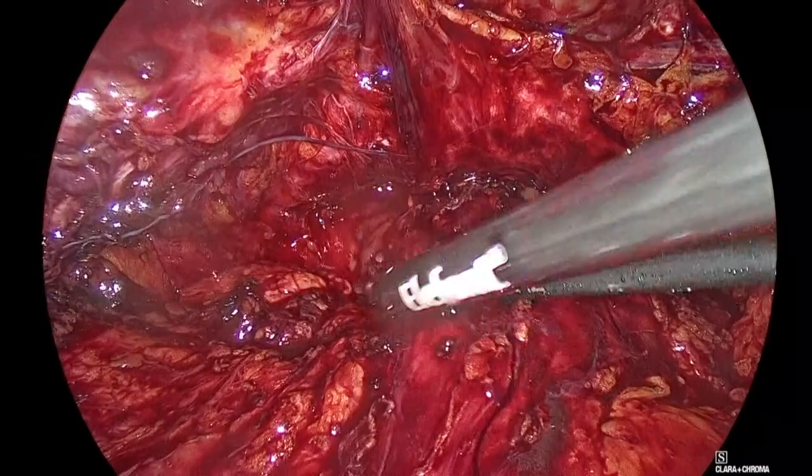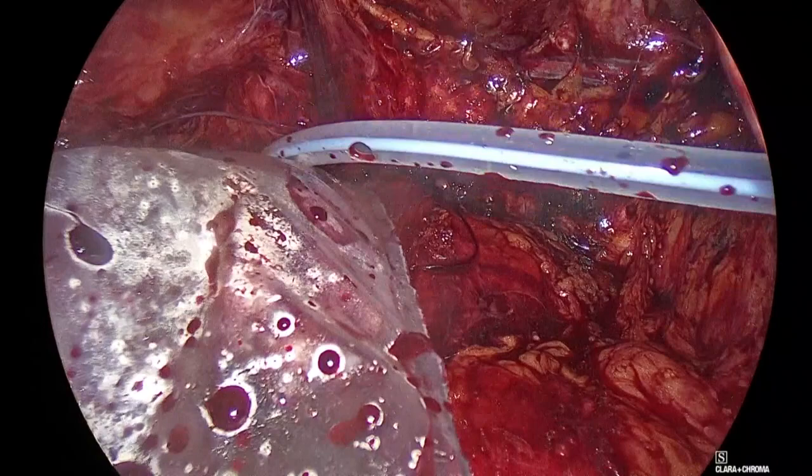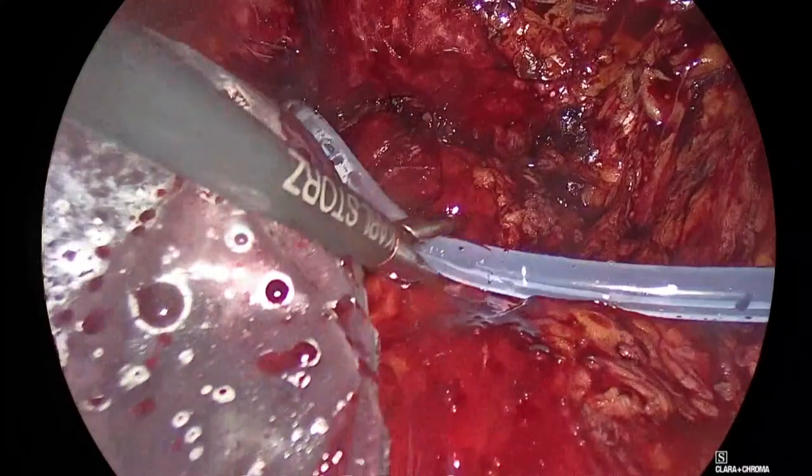Okay, let's see. We will see it again, Panagiotis. I put some tension and we will see it again. Good. Tight, Panagiotis. Give me a strong grasper, please. And put a grasper here, please, also. Close this.